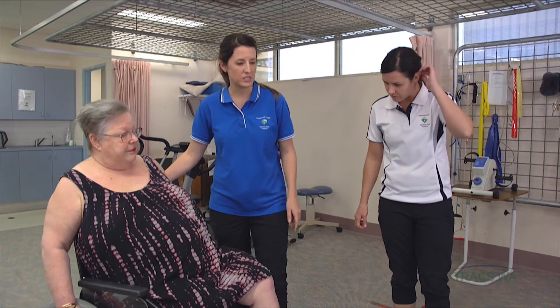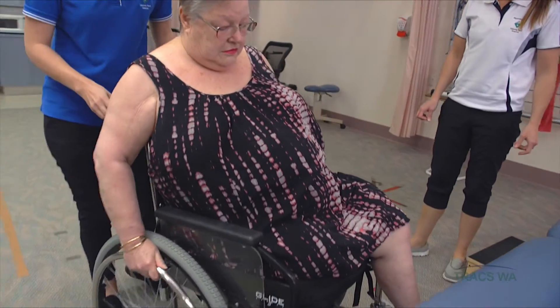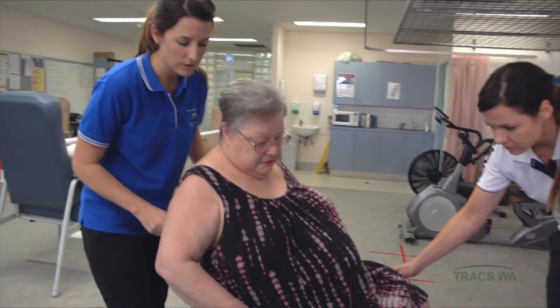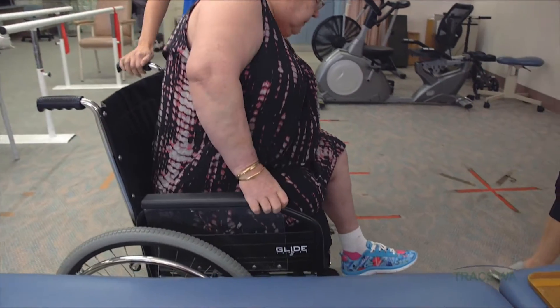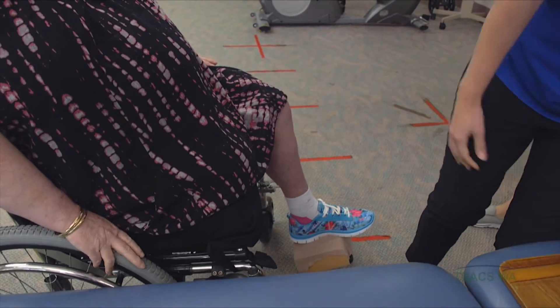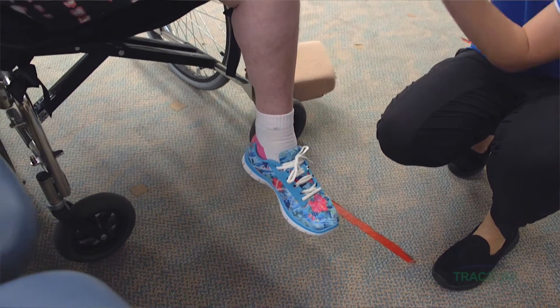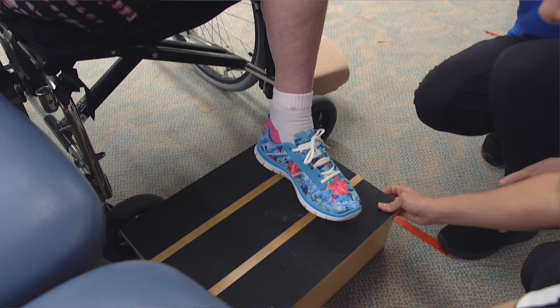We'll get you to start by coming up next to the plinth with your right side up against the plinth, nice and close. I'll just readjust you a little bit — put your brakes on there for me. We're going to take the armrest off first and put the footplate out of the way. The reason we do that is we don't want you putting weight through the footplate, because it might make the wheelchair tip when you do the transfer. But because your leg doesn't reach the ground, we're going to put the box in place to help you have a bit of leverage when doing the transfer.